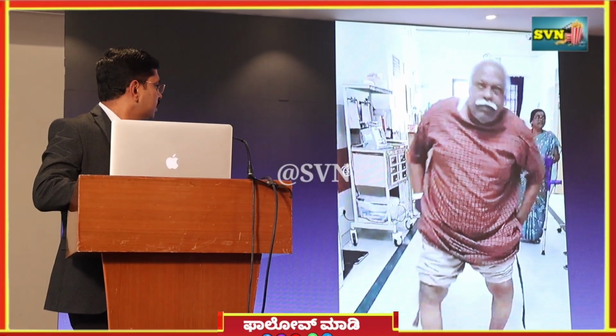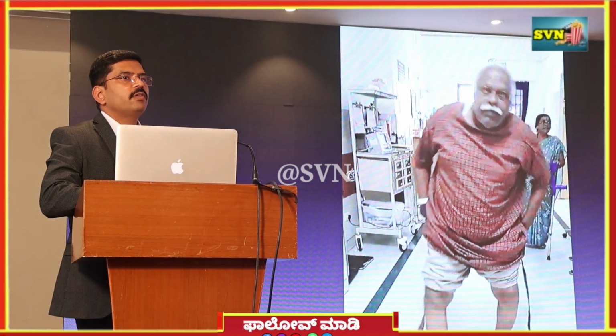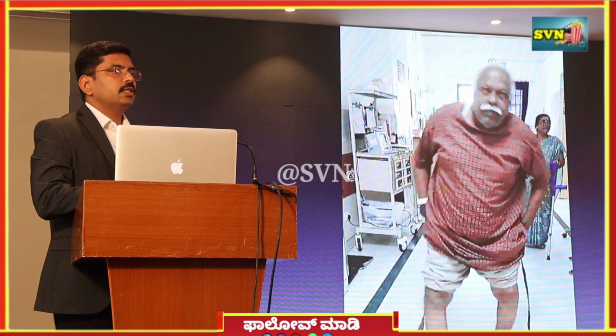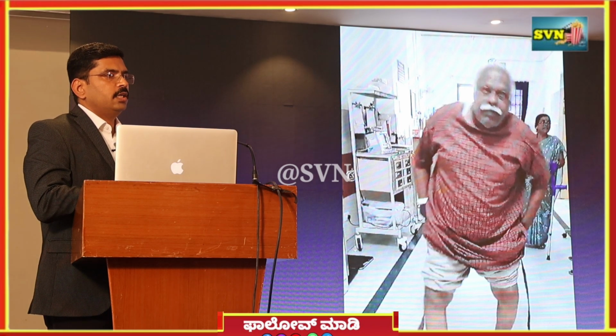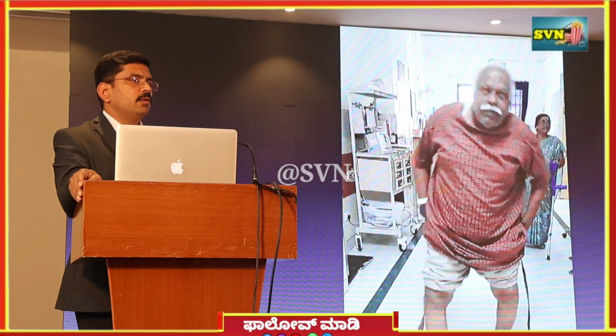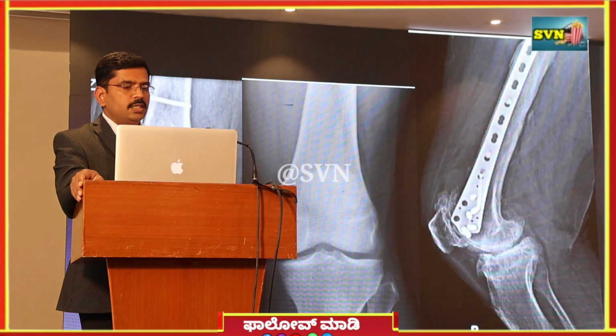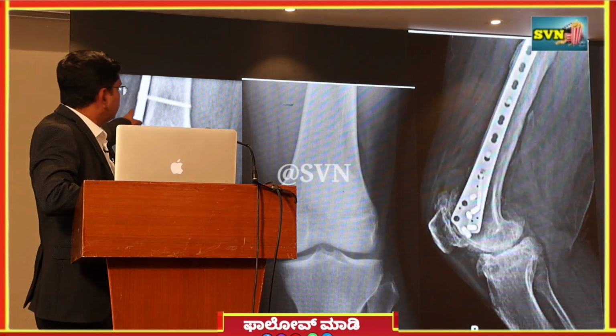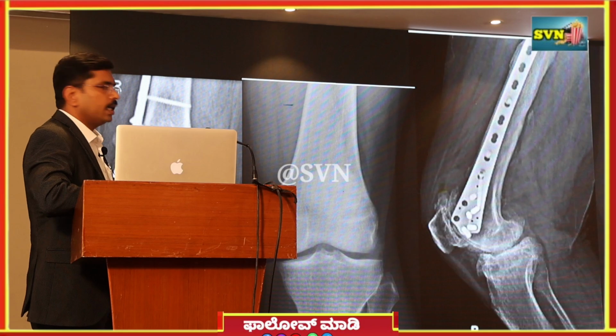He has undergone surgery in his right leg 7 years back in Kerala. So with the effort of the surgeon, the fracture on that side has united. But with time, he has developed a deformity in the knee. His X-ray would look something like this. He has a knee where there is an implant inside. The knee is badly damaged.